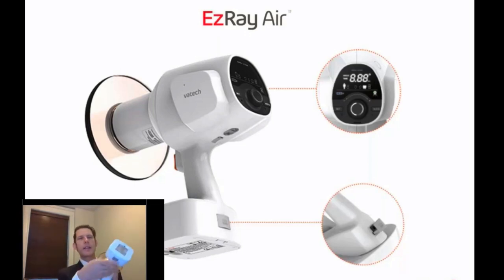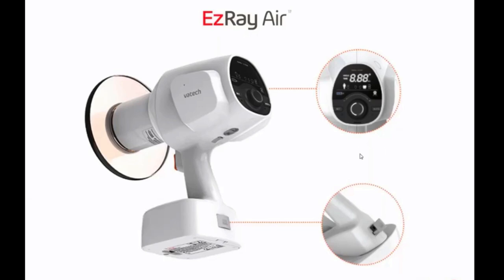To charge this we can use our charging button right there. It takes about 1,000 x-rays before it needs to be recharged, so usually that is going to be one full day of charging for your office. On the back is the digital panel with very simple touch buttons: your time, man, woman, child, and your tooth setting. Very simple to use, very lightweight and easy to manipulate.